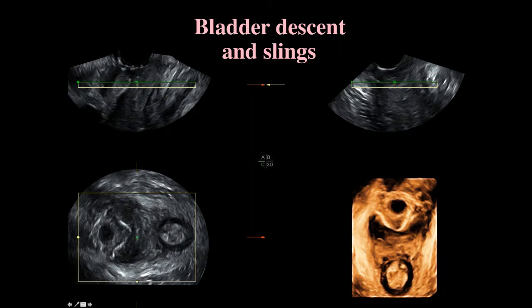So when you take your 3D here, what you're rendering is just the part in that rectangle. And so you see the mesh right here, and here is our sort of enhanced view where you can actually see the mesh is slung around. And many people that I see with meshes are actually pretty happy with them, seem to be quite pleased, except of course when they don't work, which I'll show you some examples of.